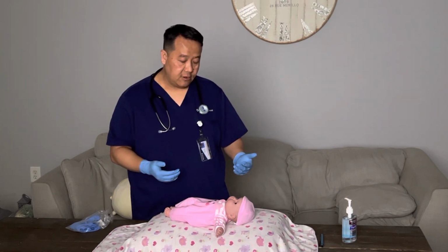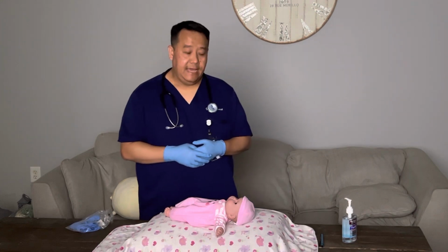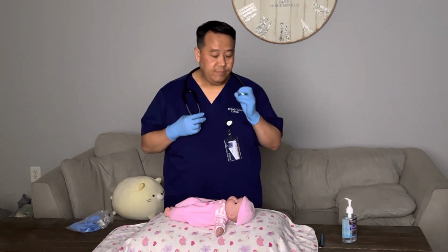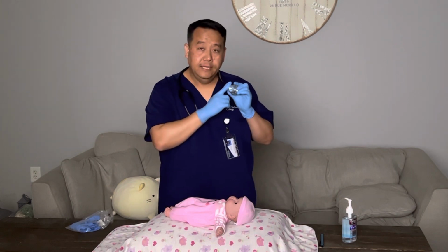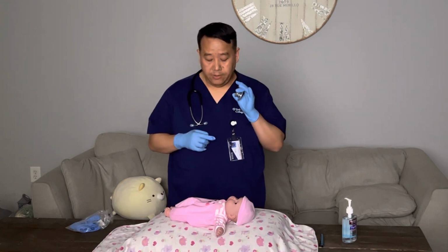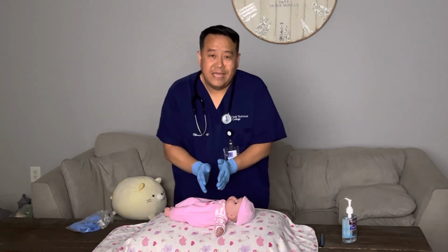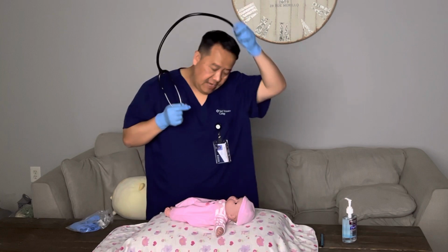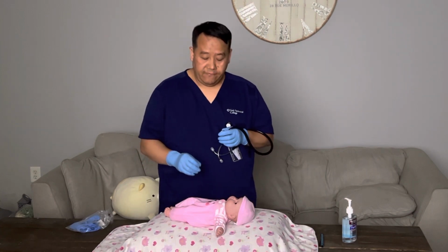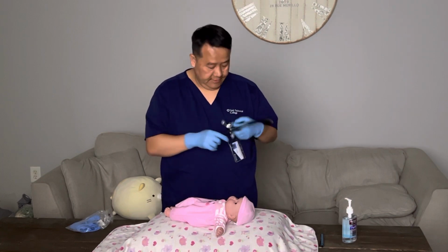Next, I'm going to check her cardiac or her heart rate, and how I do that is I should use a pediatric stethoscope, but I don't, so I'm going to use the bell of my stethoscope. The reason why you want it smaller is so that you don't get any of those bowel sounds along the heart because they're so tiny, right? So you go right over the, you check for the apical pulse, and that's gonna give you the best sound.